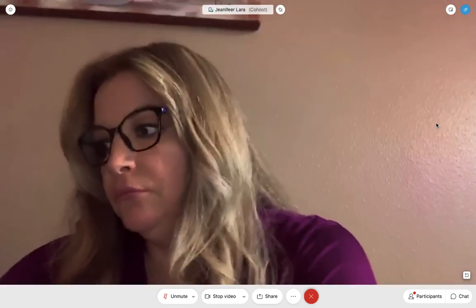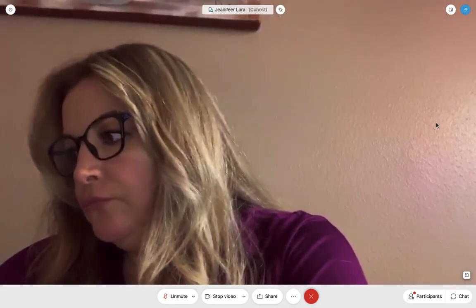Thanks. So when we're talking about the focusing cup, when it gets its charge, I was reading that it gets a strong negative charge. Right, it has a strong negative charge. And it's supposed to do that to keep the electrons in the cloud that are released from the filament. So my question is.